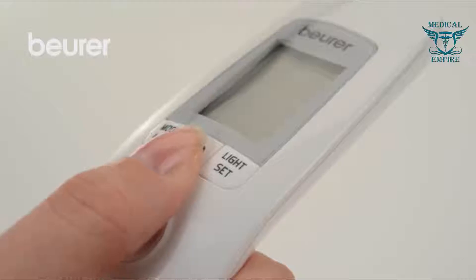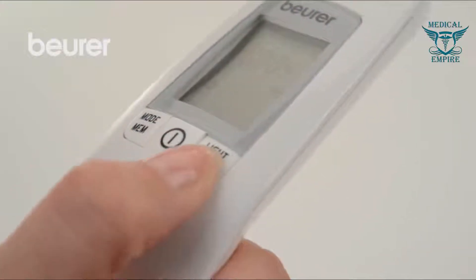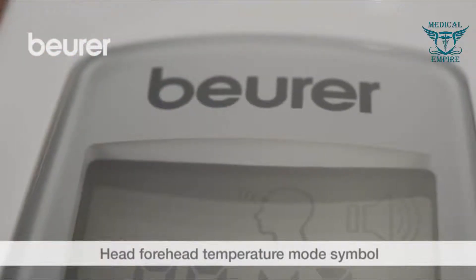To measure the temperature on the forehead, switch on the device and wait until the full screen view opens and you hear two short beeps. Press the mode MEM button. The head symbol indicates forehead temperature mode.